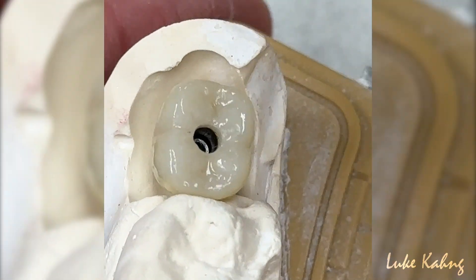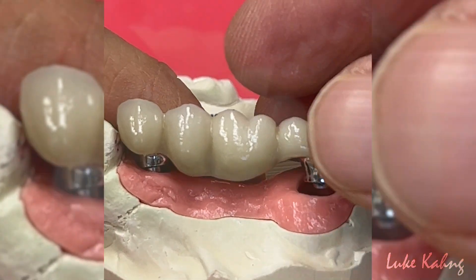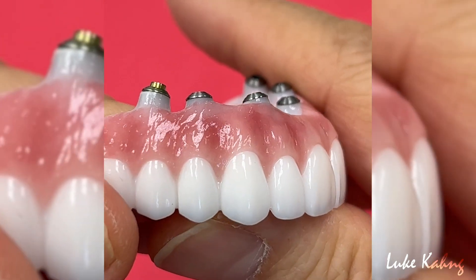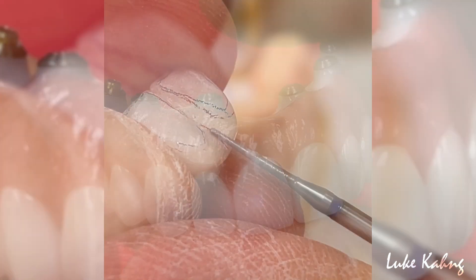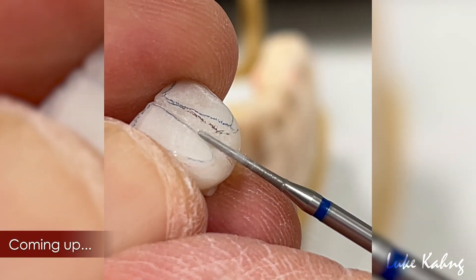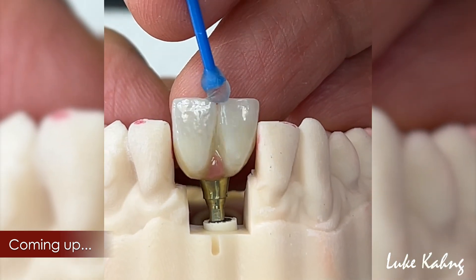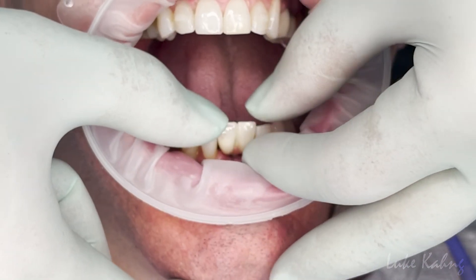Implants are a common and popular dental restoration for patients, whether it be for crowns, bridges, or full mouth arches. Implants are a great option to go with, so long as there's enough bone in the jaw. In today's video, we'll be going over the fabrication of one of our zirconia implants. This implant is being placed directly in the middle of the lower jaw.